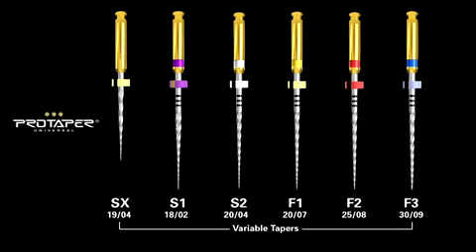I'm going to show you the ProTaper system. ProTaper came to market in 2001, and at this moment, it is the most utilized system in the world. So this is what Ruddle is using because it has the most success of any file ever made. There are three shaping files, and you can see that there are three finishing files, and appreciate that there's actually an F4 and an F5, but we're showing you today what is typically generally most utilized.